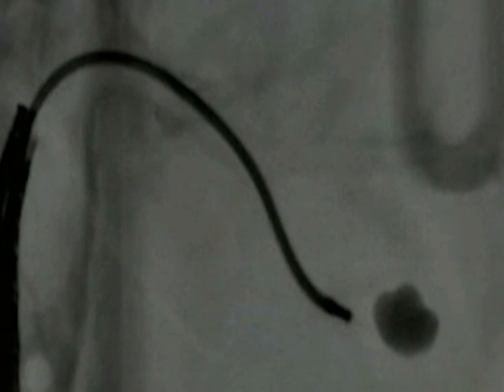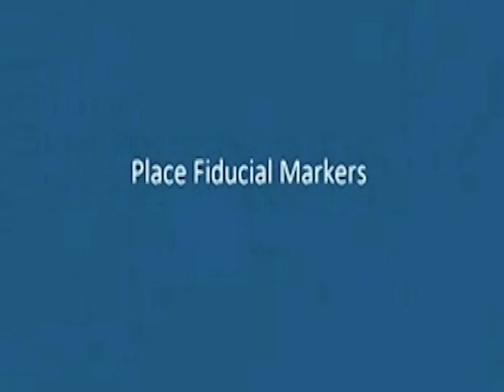So this is looking at what the scope and what the working channel look like under fluoroscopy. You can do a whole bunch of different things. Here you're putting a fiducial, which means just a marker that can be left to be seen radiographically to guide radiation therapy. You can put a forceps out and get biopsies. And you can also do things in the central airways with a lot more precision than you could ordinarily. So in a lot of ways, this is also replacing endobronchial ultrasounds.